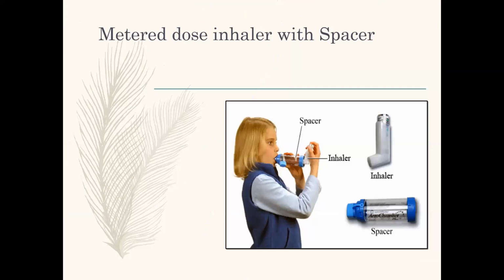So the first type of inhaler that you're going to see in this picture, in the top right-hand corner, is called a metered dose inhaler. This client also has a spacer that they're utilizing. We see spacers utilized quite a bit in children. However, with our recent COVID outbreak, pandemic, we have seen spacers being utilized in our adult population.